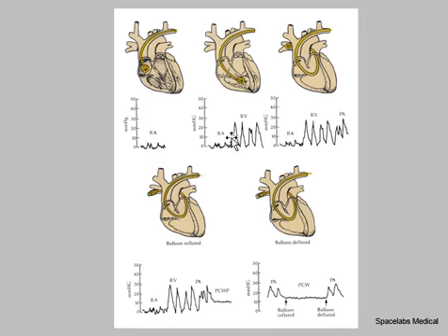You should see the right ventricular trace. It doesn't look very nice, but this is real life. My studies are real life too, but I've been highly selective in what I've shown you. And the catheter then courses. It's been recorded in the right atrium, the right ventricle, and now it's sitting in the pulmonary artery.